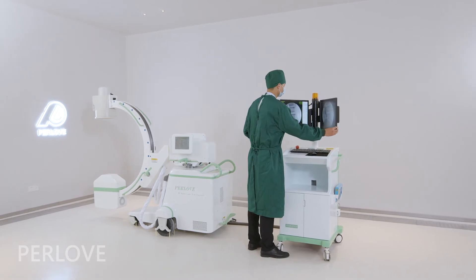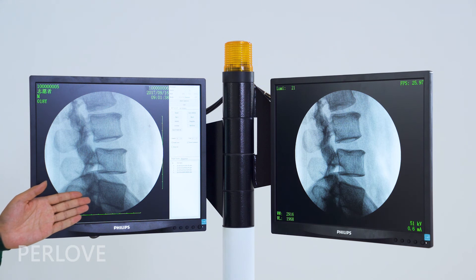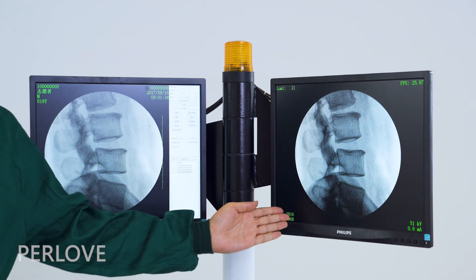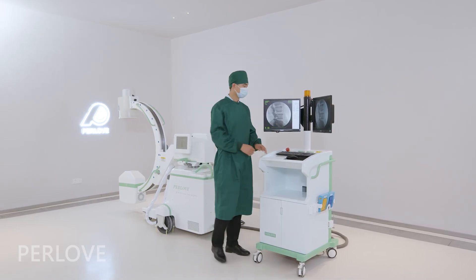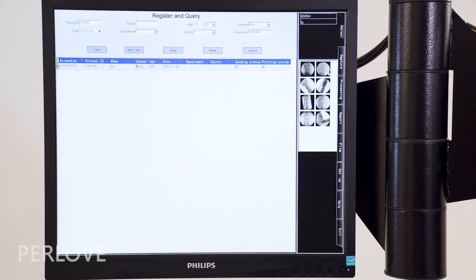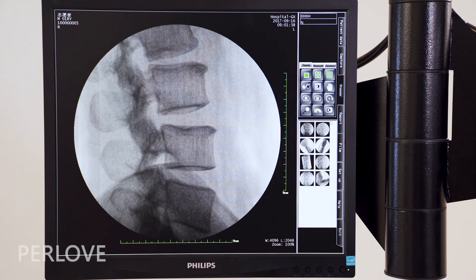The machine comes with LCD displays. The left one is the main display and the right one is the real-time display. This machine combines the functions of registration, image capture, image processing, and case report printing.